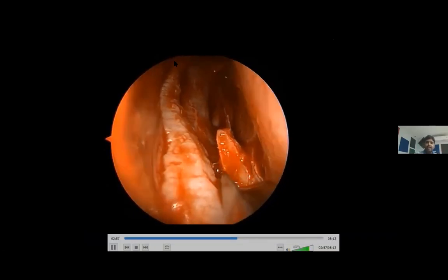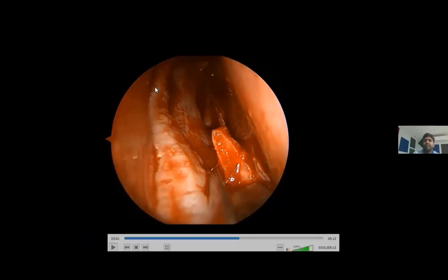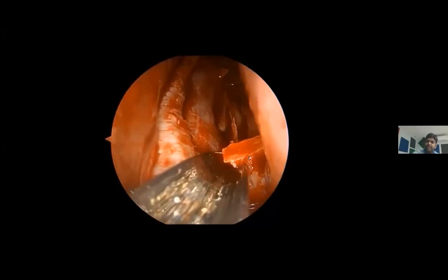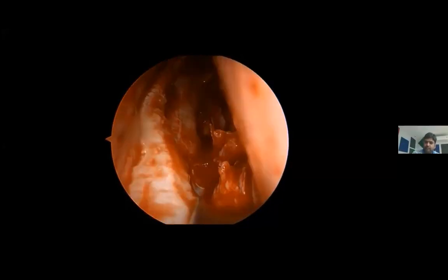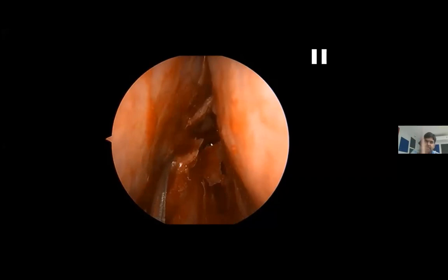This is the strip of the cartilage attached to the mucoperichondrial flap, and this is the spur which is still attached, but the mucoperichondrial flap is free above and below. Now we chisel it out. See, the chisel is directed towards the non-deviated side and directed on the maxillary crest. We chisel it out, and then the anterior maxillary crest, which has been supporting this inferior part of the cartilage, is already gone. Now the cartilage is without any support from below and from above, and posteriorly it is attached, which we will work on later, but it is already made unstable from above and below.